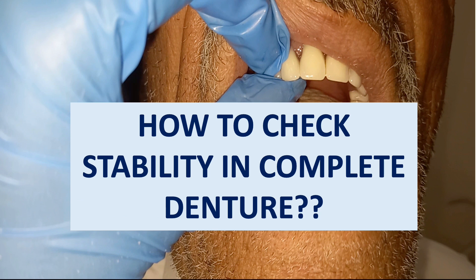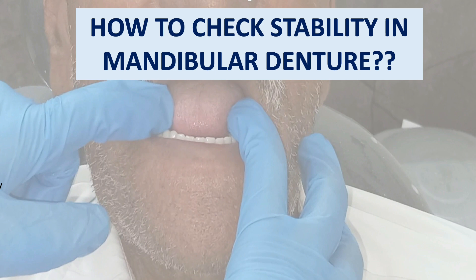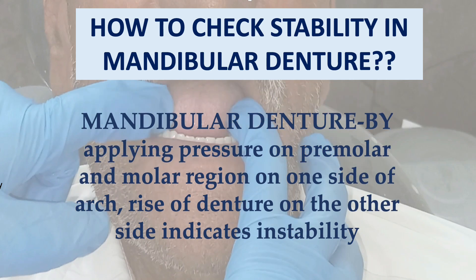Let's see how we'll deal with the stability of complete denture — in both cases, mandible and maxilla. In mandibular denture, you can check stability by applying pressure on the premolar or molar region of one side of the arch. If there is a rise of the denture on the other side, it means the denture is unstable.